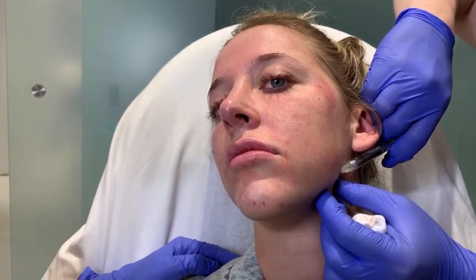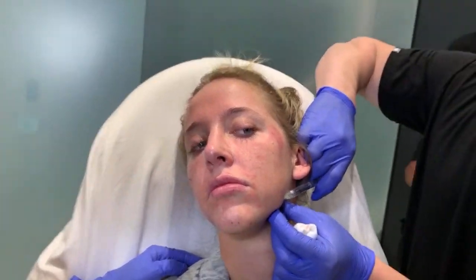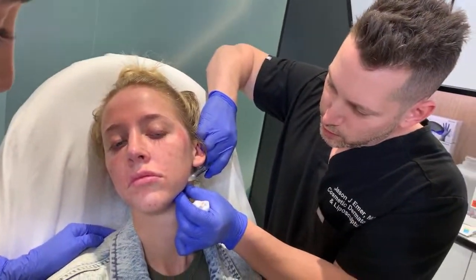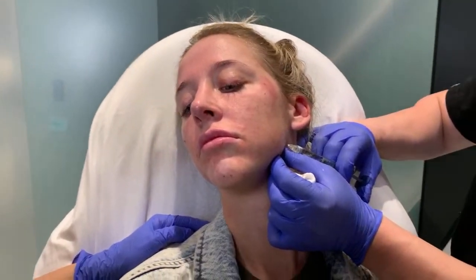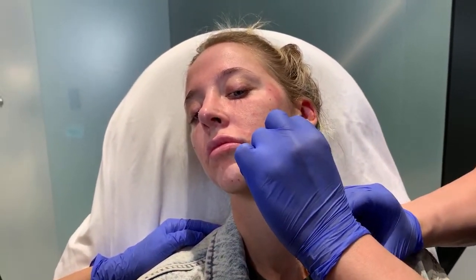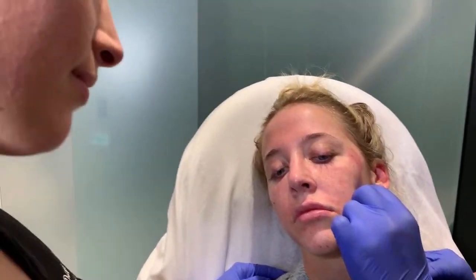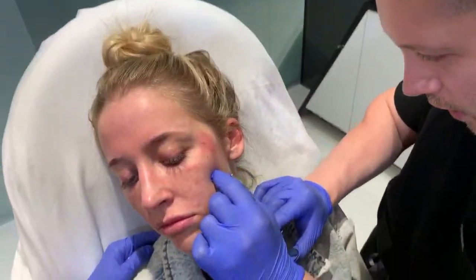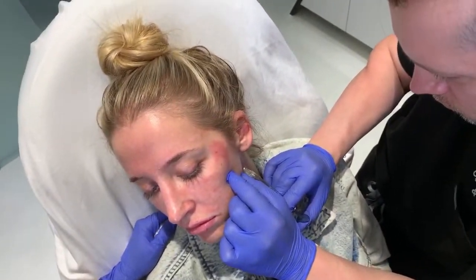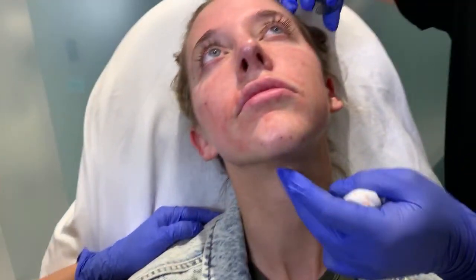And we're gonna use Juvederm again. She's doing great. Now, not gonna do a lot, just a subtle amount. This will also make it so it doesn't feel like she's as sort of hollow. She'll be a little more lifted in this back area. Look up for a second. Yeah, right there. Perfect.